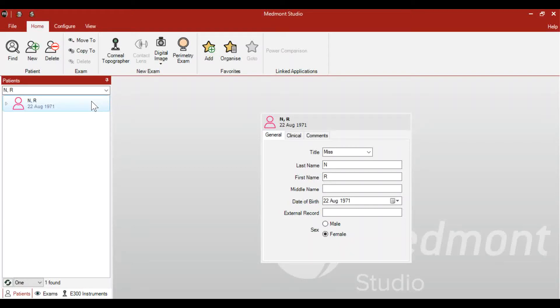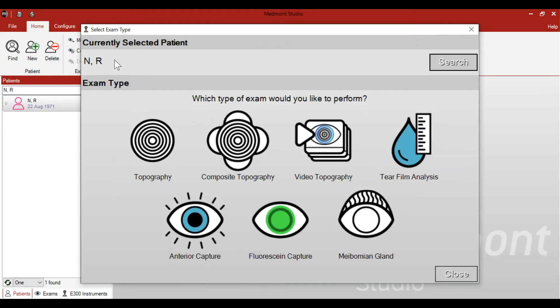This video reviews the many capture options available in your Medmont Meridia topographer. First, start by creating a new patient. Go to Home and New, then enter your patient information. Once selected, you can go up to the corneal topographer capture icon, which brings up a window with many different capture options.